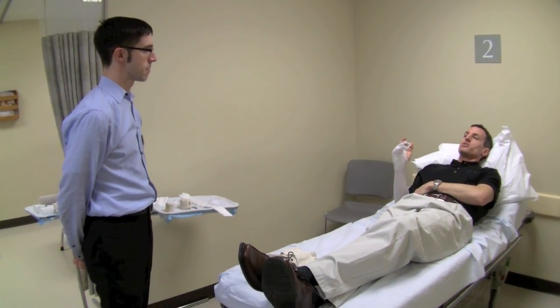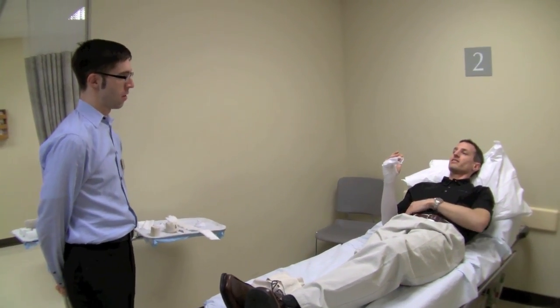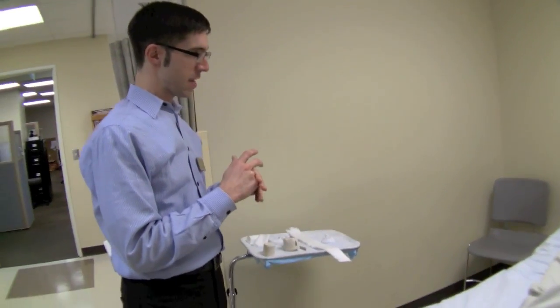What are some of the key elements to a successful ulnar gutter before we even put the fiberglass on? There are a number of ways to put a splint like that on, but one key thing — though hard to do with an injury — is to get flexion at the MCP joints. The reason is that the collateral ligaments on either side of the joint, when straight, are relaxed. If you leave them straight for a long time, they can scar down in that relaxed position, making it hard to get those fingers to bend again. Having the fingers bent keeps the ligaments on a stretch so they can't shorten up.